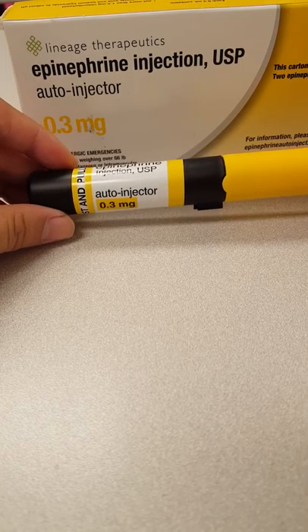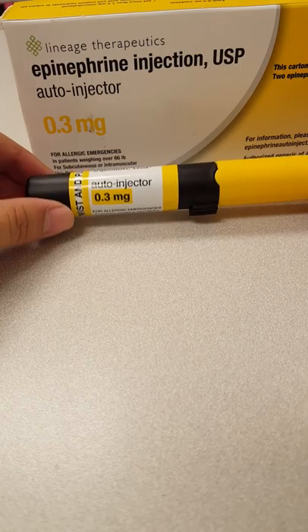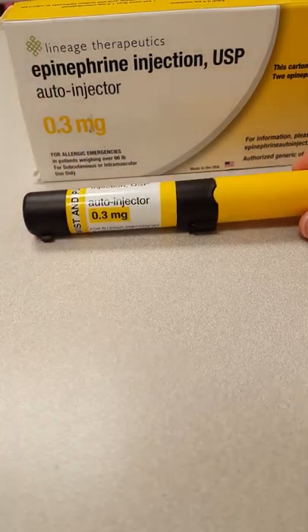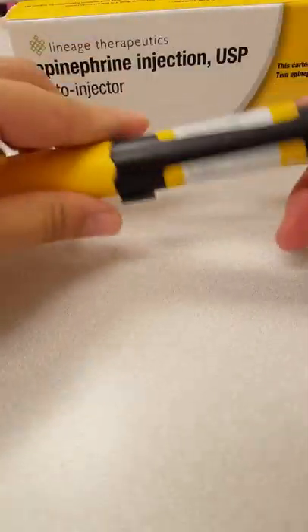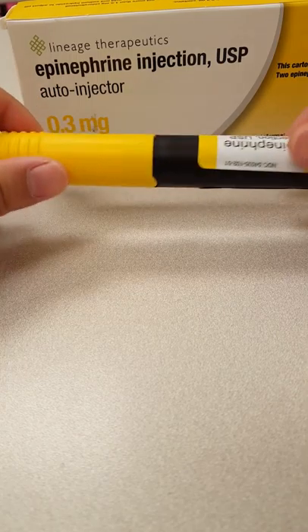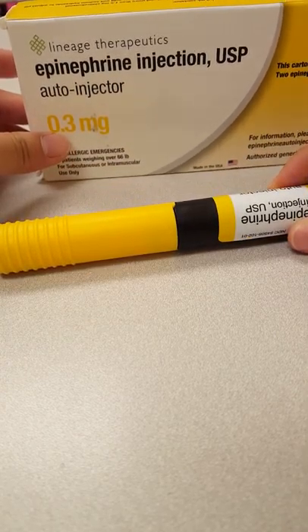Or you can use a topical ointment like a hydrocortisone cream or something similar. Inside this packaging — this is for adults. If you have the one for children, it'll likely be fewer milligrams.